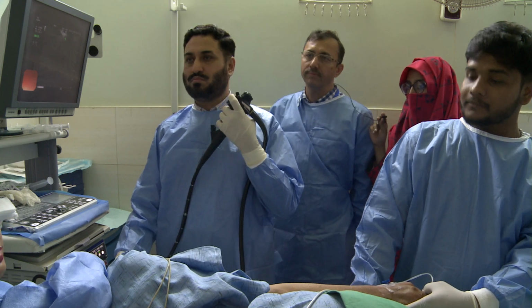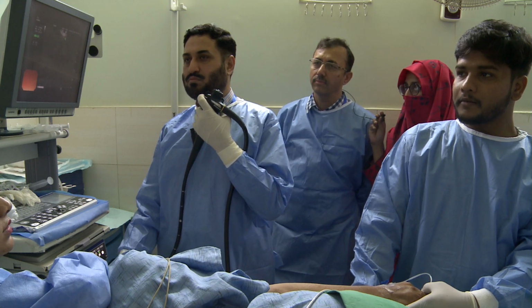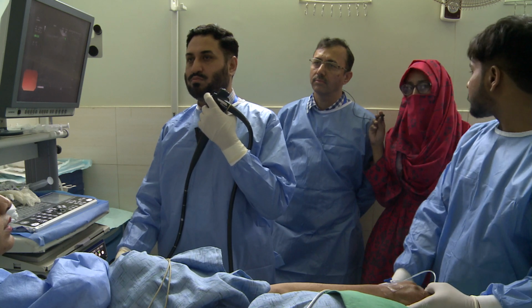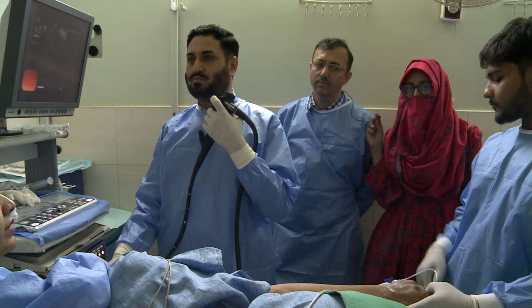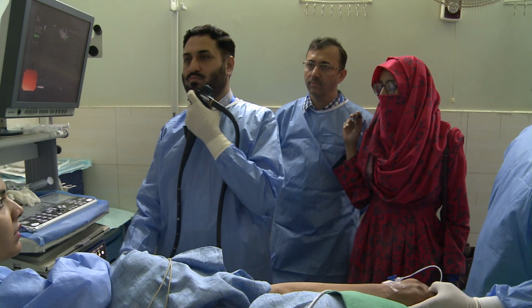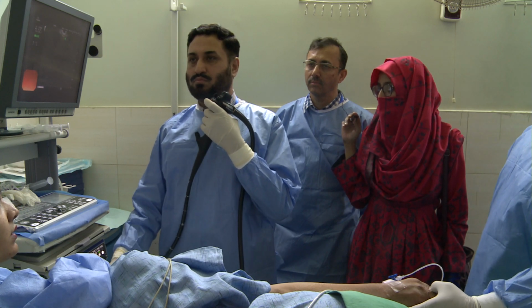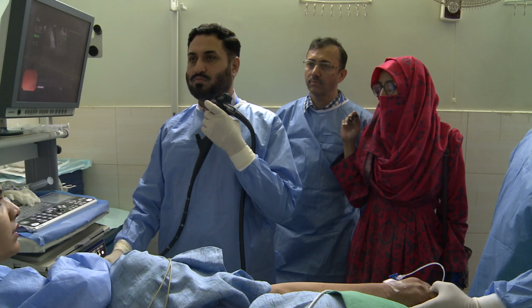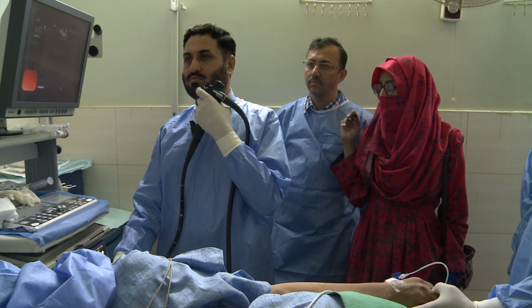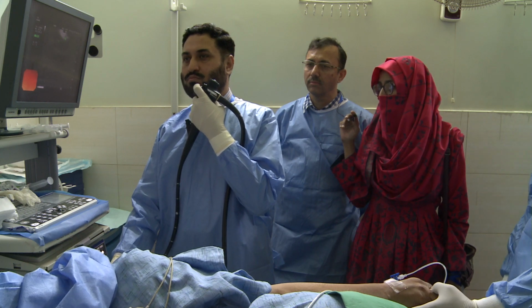So we have a 55-year-old male patient, known case of diabetes, who presented to us with a complaint of abdominal pain and epigastric fullness. This was for 5 months, and his CT scan showed that there was a diffuse swelling of the pancreas extending from the head of the pancreas till the body and tail, and there were findings of acute on chronic pancreatitis, necrotizing pancreatitis. His amylase was done in January, which was 32.